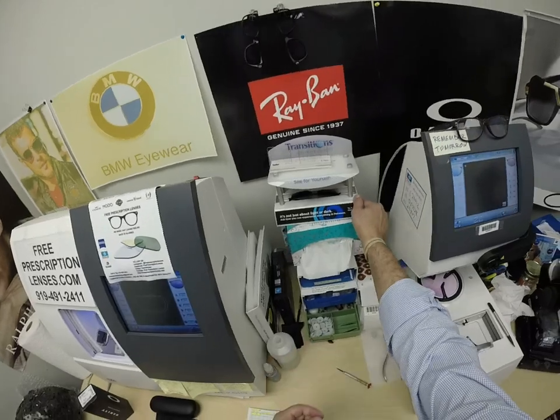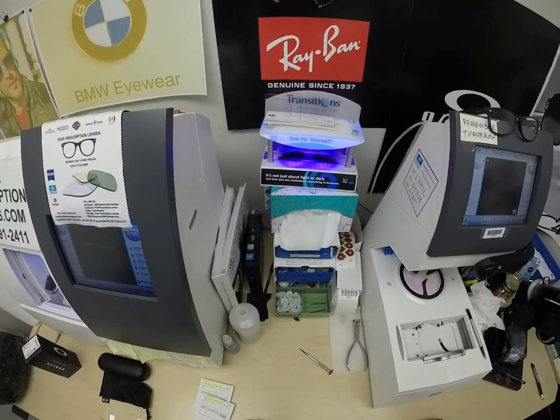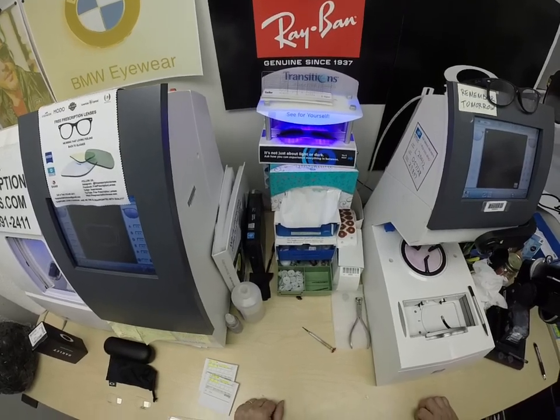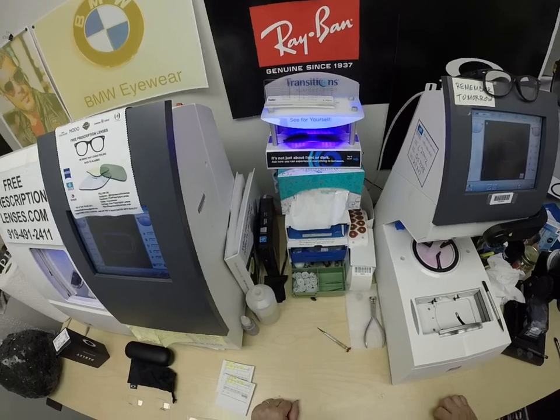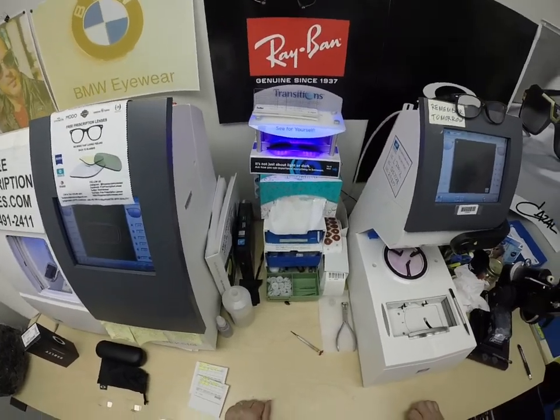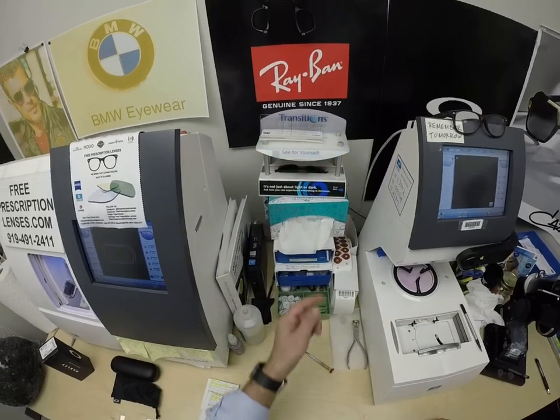All photochromic lenses get dark on day one and continue to darken every day for the first couple of weeks they're exposed to the sun. After that, they work for years at maximum performance. The only time they won't work perfectly is if you're behind the windshield of a car — your windshield absorbs the sun's harmful ultraviolet rays, which would cause your dashboard to crack from sitting in the sun all day. That's why they don't turn dark in a car.